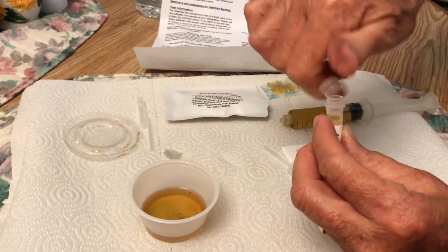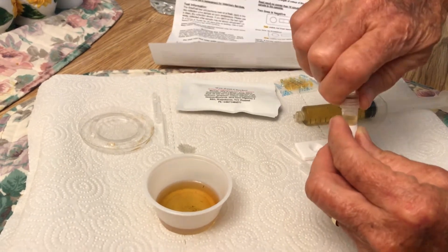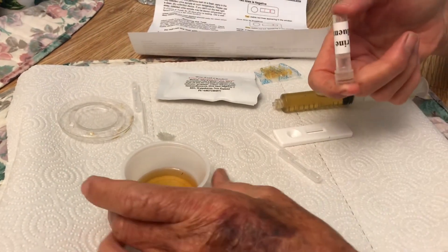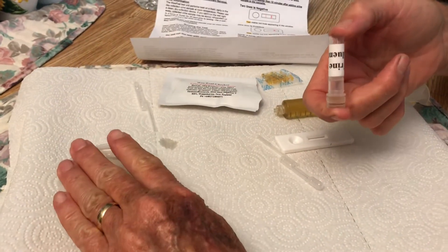Put the cap back on. Turn it upside down twice to make sure it's mixed up real good.